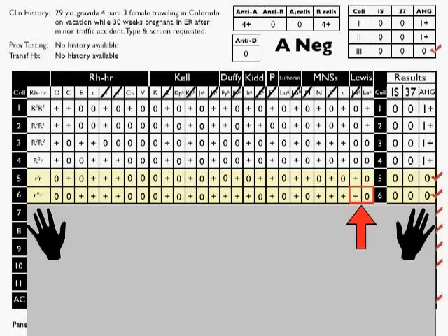Okay, so cell 6, same argument. Lewis A, double dose, single slash. Slide over to big S and little s. You have single dose expression of both, so neither one can get a rule out. M and N, you've got double dose expression of N, put a single slash. Lutheran B, another double dose, another slash. P1, this is the only antigen present, put a slash the other direction.